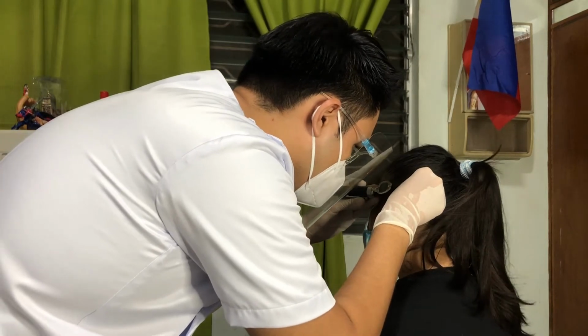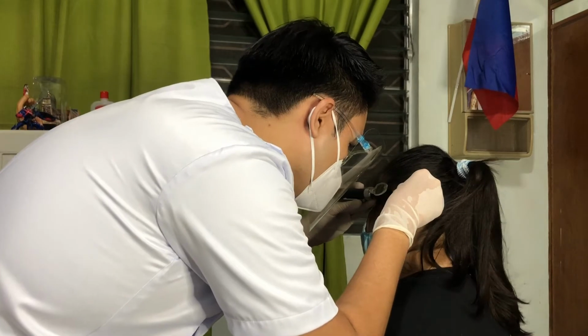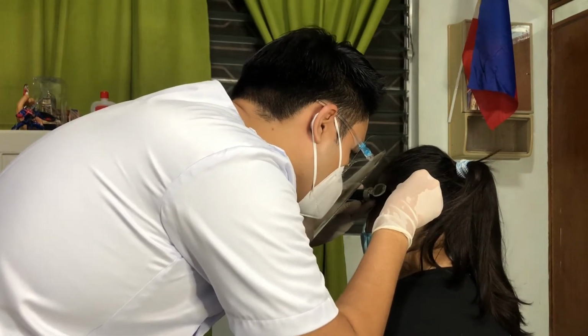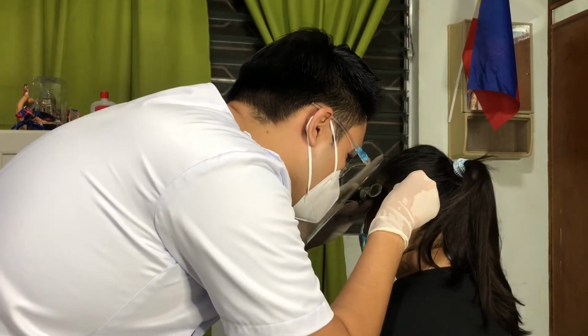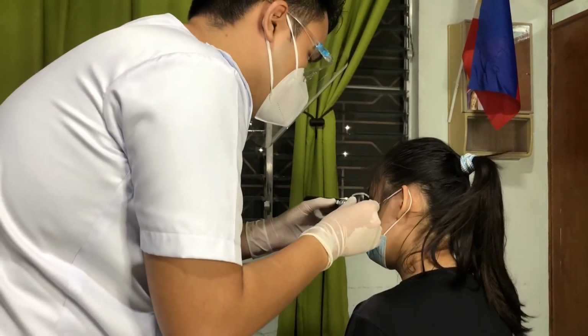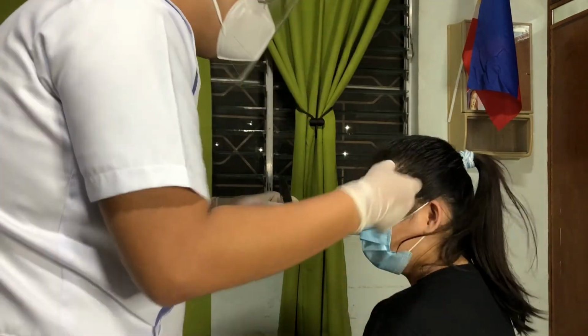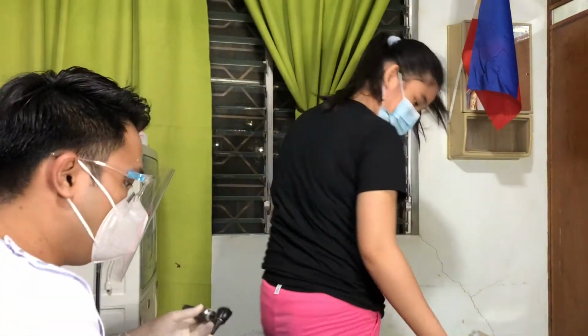Then gently insert the otoscope in the external auditory canal carefully, advancing it until the tympanic membrane is seen. Check for cerumen, color, lesions, discharge, or foreign body. To complete the examination of the ear, the patient's hearing should be assessed using the tuning fork and audiometry.